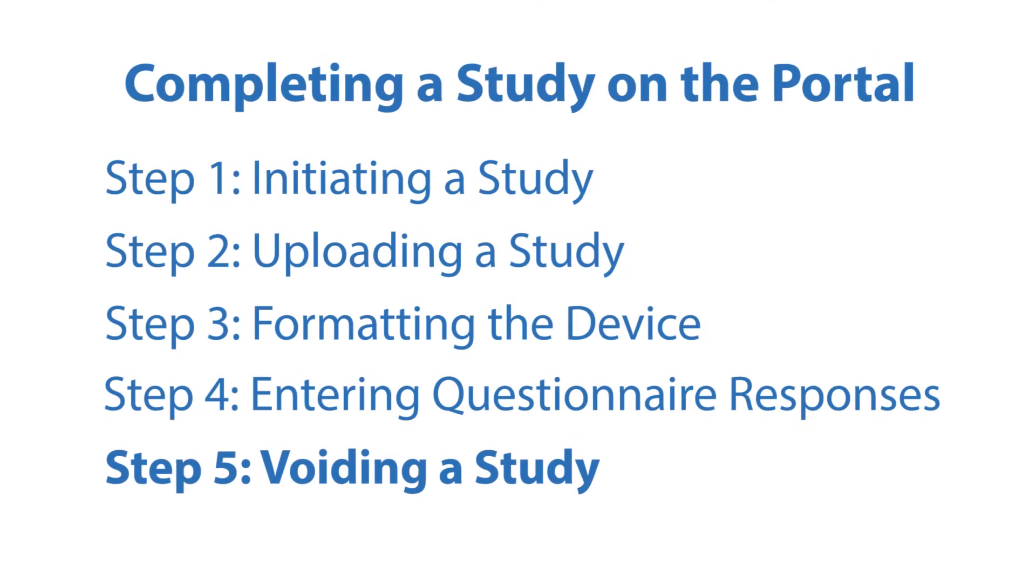Step 5: Voiding a Study. If a study was initiated and is no longer going to be used, the study can be voided.